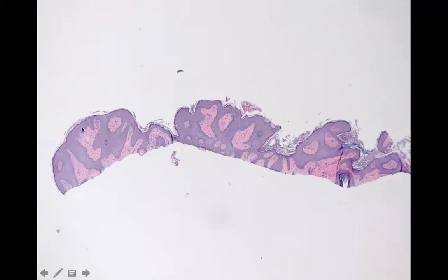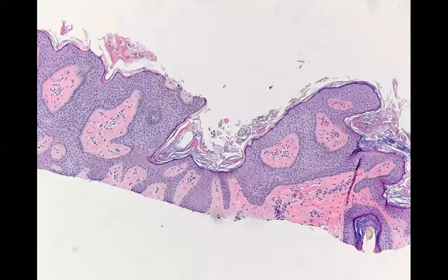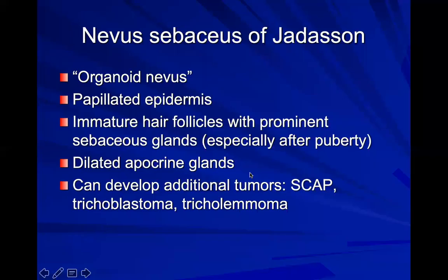And basically you have papillomatosis or acanthosis of the epidermis, sort of shaped like a seb, a little bit of hyperkeratosis. And often you'll have a straight bottom, which in this shade you can't really appreciate, but without a clinical history, if this is an adult, it could be very difficult to distinguish from a seborrheic keratosis. If it's a 5-year-old, your best bet is epidermal nevus. And here you can see a little bit of pityrosporum yeast on the surface because it's probably in a seborrheic distribution. But other than that, you just see proliferation of normal epidermal cells.